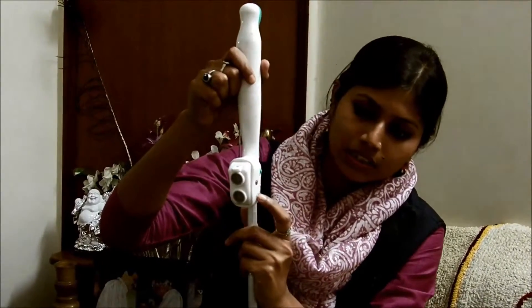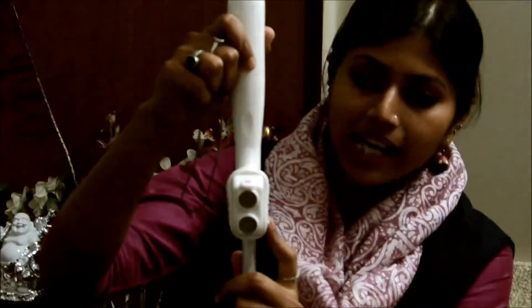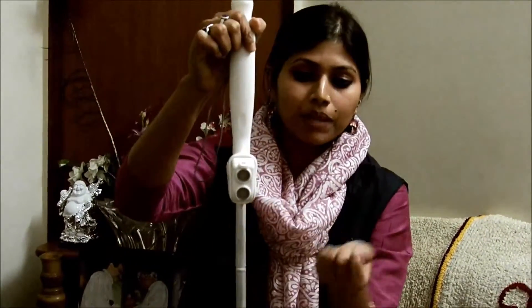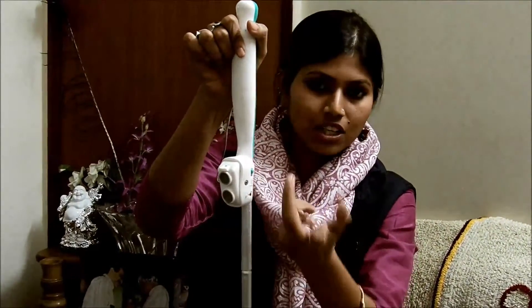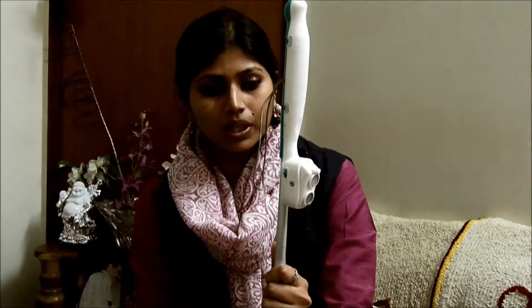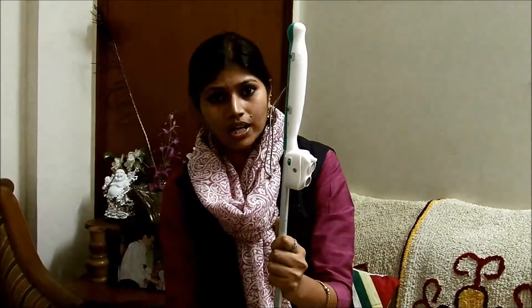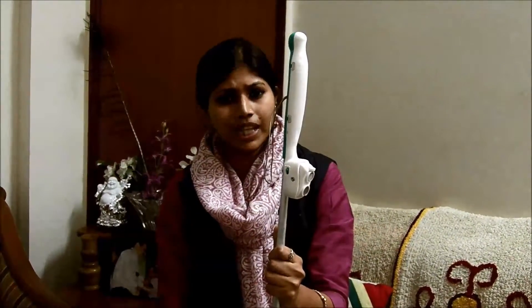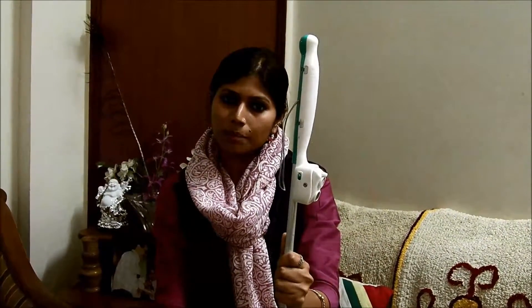Below the mode switch is the power slot. This device has an internally rechargeable battery fitted — you can simply put the charger in this slot to charge the device. If it's fully discharged, it takes about 3 to 4 hours to get fully charged, and you can use it for about 8 to 10 hours continuously. For instance, if a visually impaired person uses it for 2 hours a day, they can go without charging the device for at least a week.